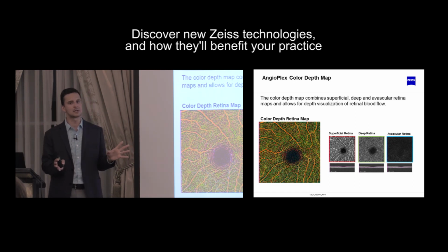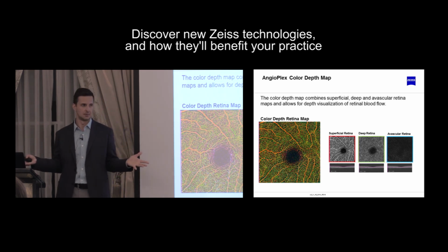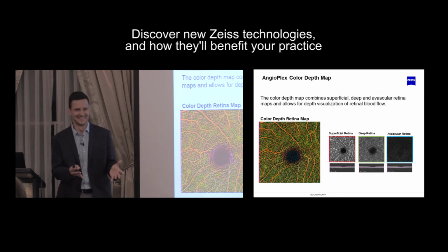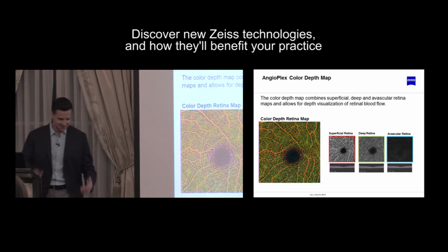And the other one I would draw your attention to is, when you think of your OCT, don't diagnose red disease. Red disease is not named after Joe Redner. That was bad, sorry, Joe. There we go. All right.